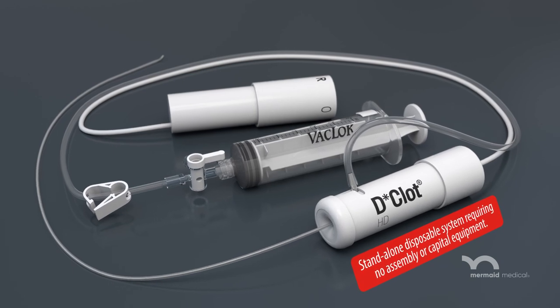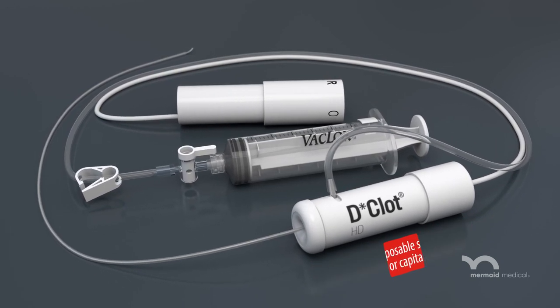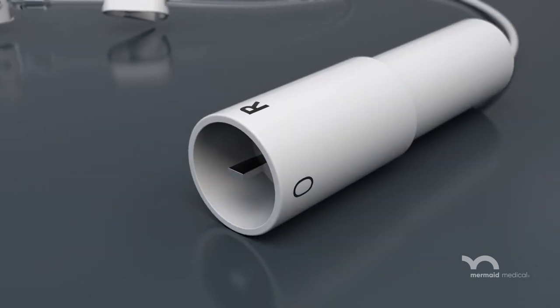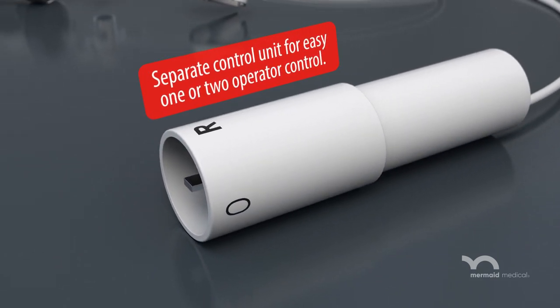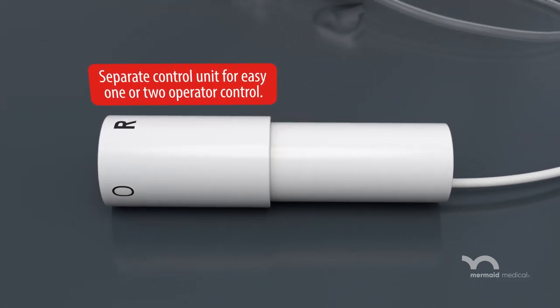The disposable system is packaged ready for use. It requires no assembly or capital equipment. Declot HD consists of a separate battery pack control unit which allows for easy operation for one or two operators.